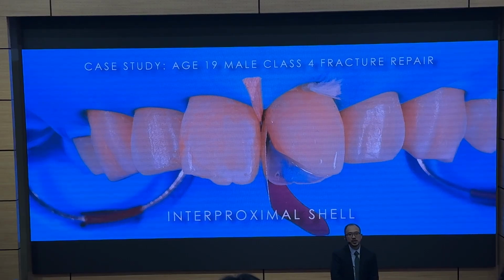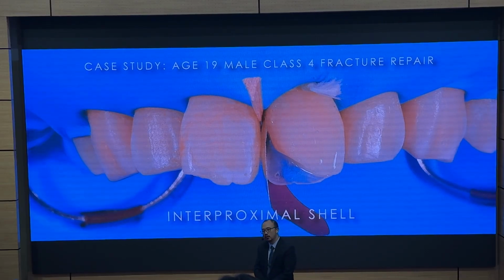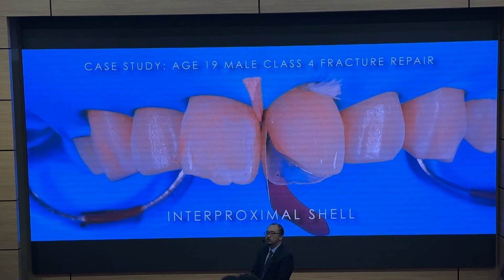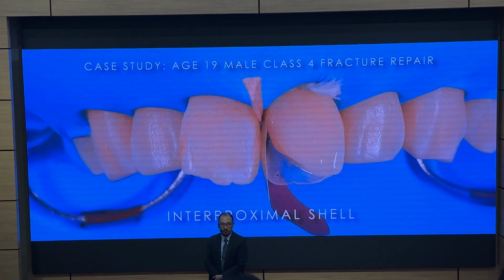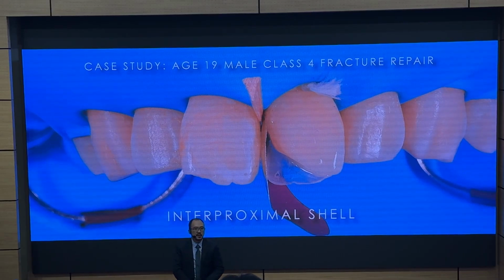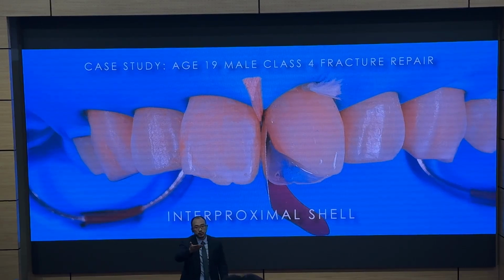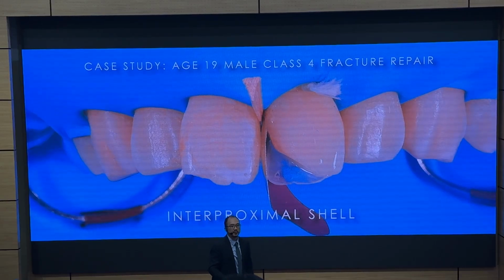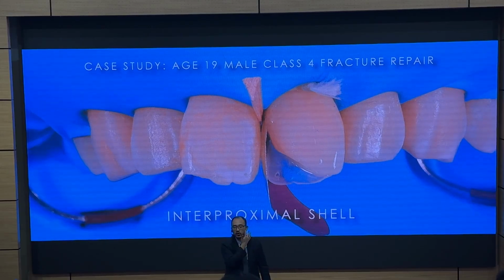And the shell is so thin, it's virtually see-through. Once I create the shell, then I'm going to create the palatal wall, the interproximal wall. Okay? And traditionally how we do it is that we would use, again, clear strip, a mylar strip. The problem with using a mylar strip is that I end up with a flat edge, which, as you know, natural teeth doesn't look like that. Natural teeth has a curvature, has a convexity that I want to copy.